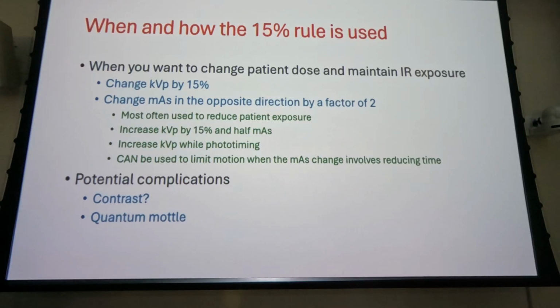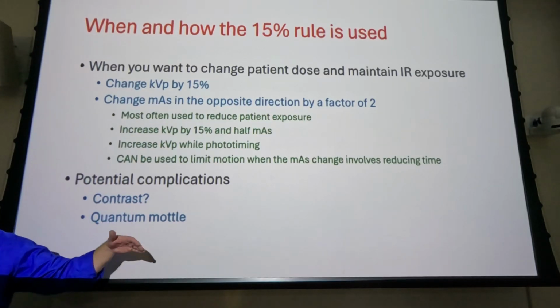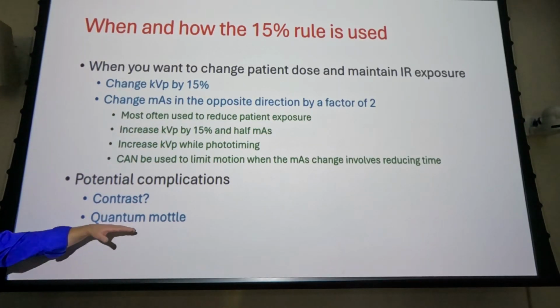You're driving out of the area and you start to lose reception, right? Or bad reception on your TV. If you've got a dish or something, sometimes if it's really stormy, you lose some reception and your picture gets all wonky. That's kind of our version of that. Quantum mottle, quantum, quantity.